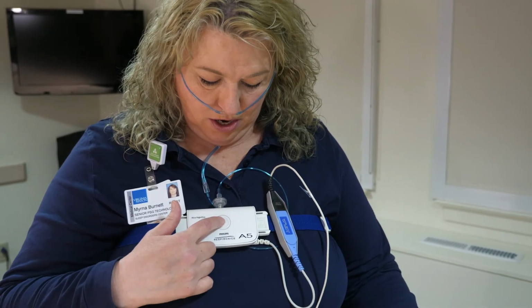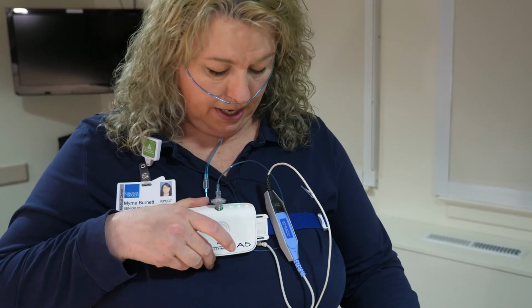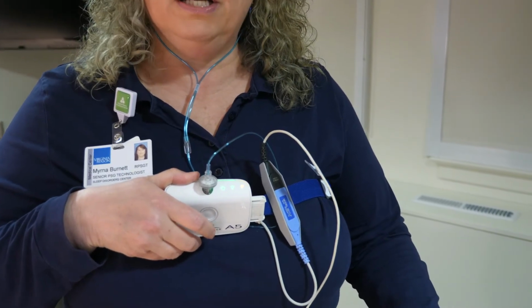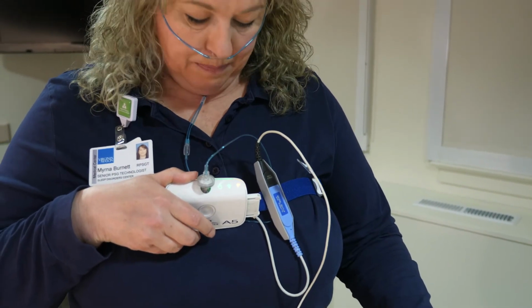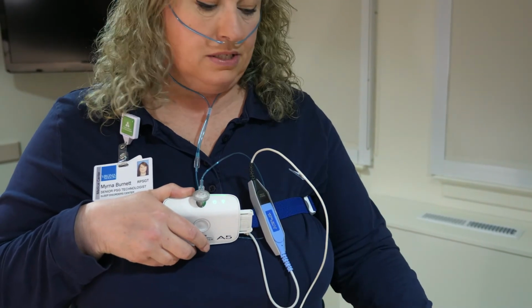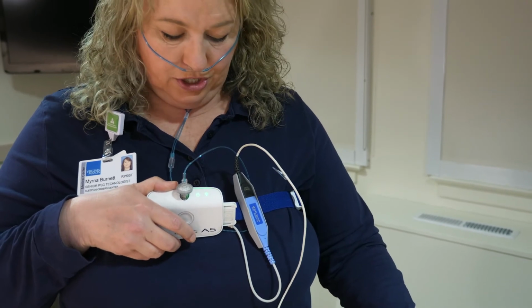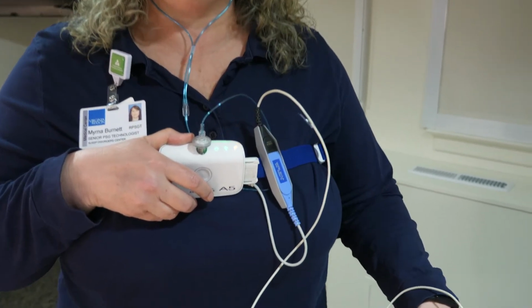Once you go back to bed, if you want to check to make sure everything is still working properly, there's a status button in the middle here. One quick push and it'll bring up the status bar here. Green is good, yellow means fix me. I happen to know that's flashing for the oximeter because I slid it off for demonstration purposes. But for tonight, during your study, if anything turns yellow, it'll tell you what you need to troubleshoot.